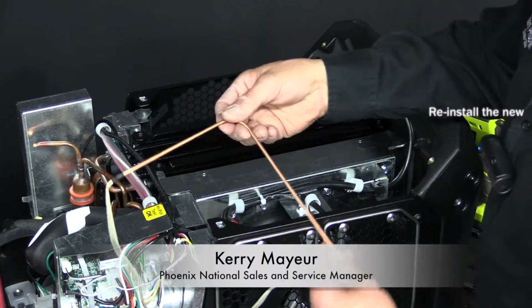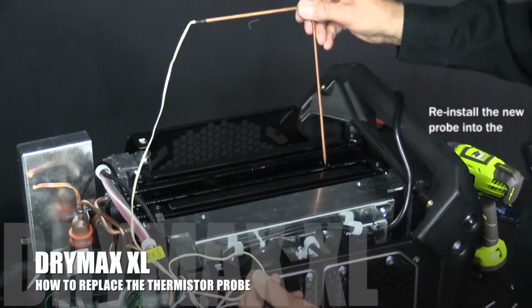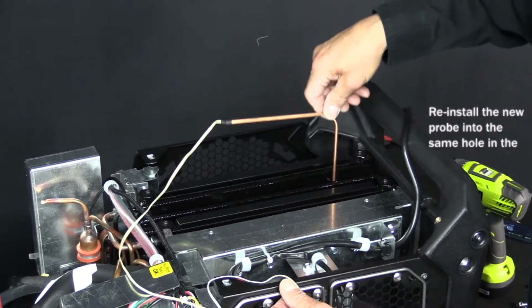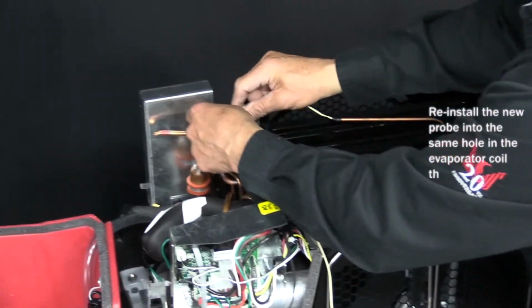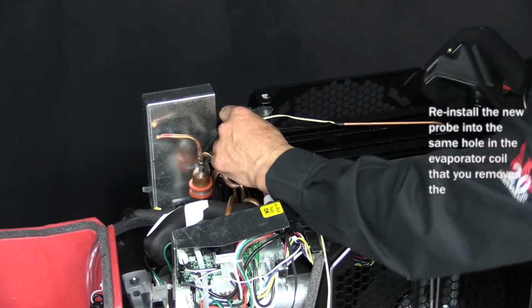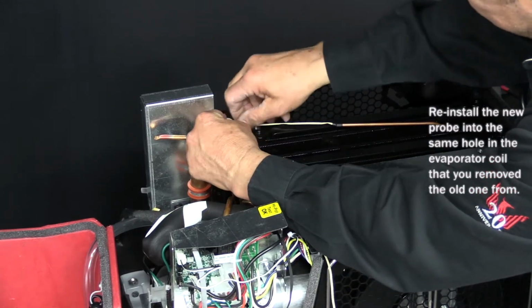Now the new thermistor probe is going to come pre-bent. Now, reinstall the probe into the same hole into the evaporator in which it came out of and push it all the way in. Once you do that, take the wire from the thermistor probe and put it into the first P-clamp, and we'll go ahead and start that screw.